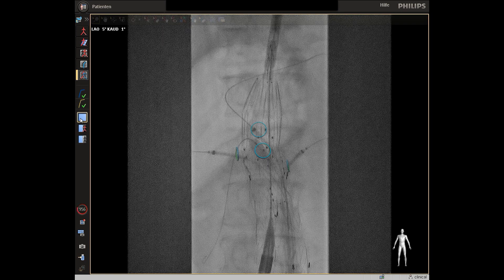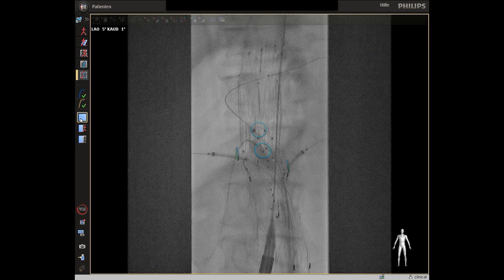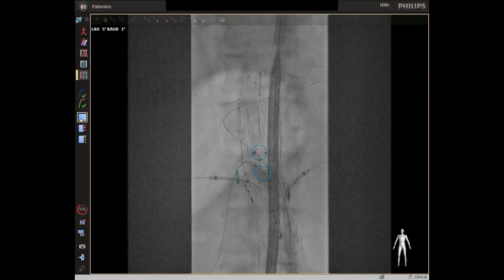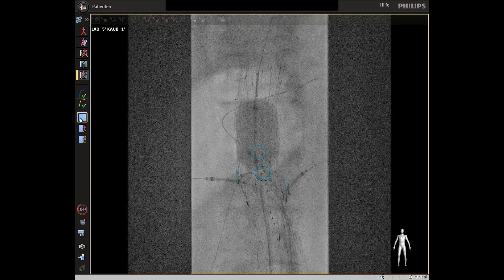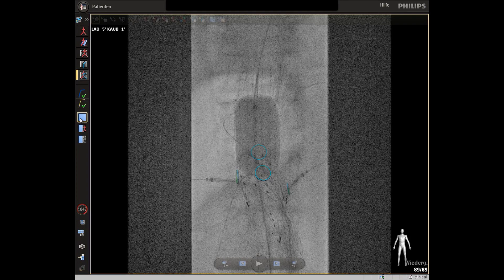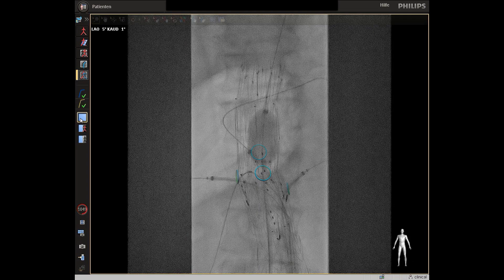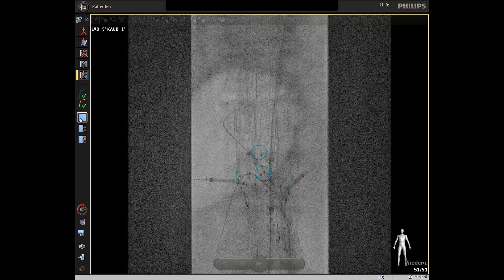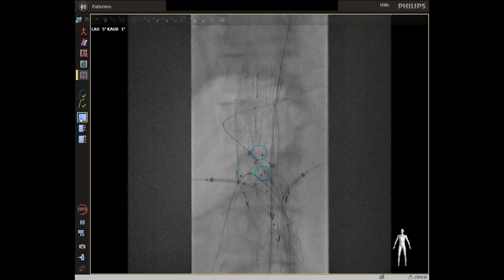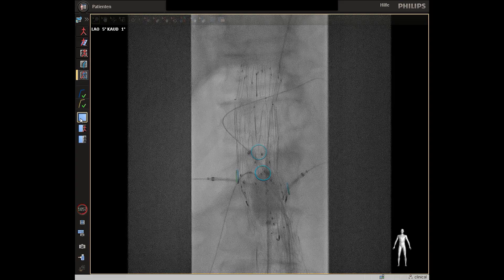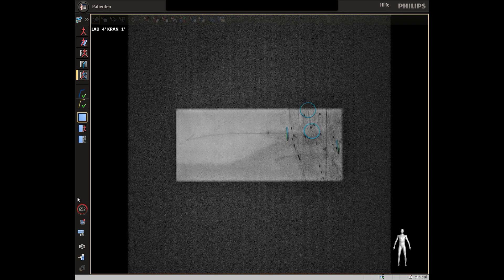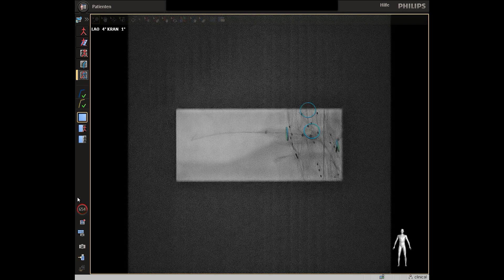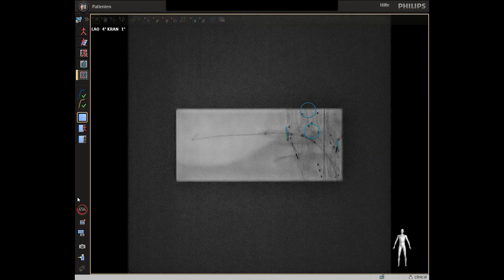In the typical next steps of a fenestrated repair, the graft is fully deployed and the top cap of the system is collected. Dilatation using a coder balloon is done in order to achieve better graft vessel wall apposition. This is done at two different levels — superior to the fenestrations and at the level of the renal fenestrations. Following this, the typical steps of fenestrated repair are performed, like deploying the bridging stent graft, which in this case is an Advanta V12 covered stent.